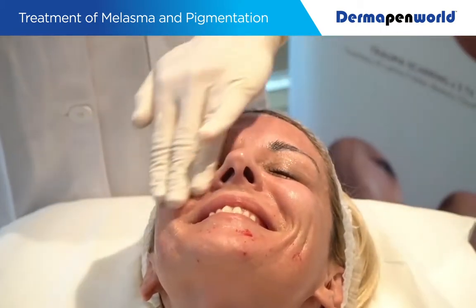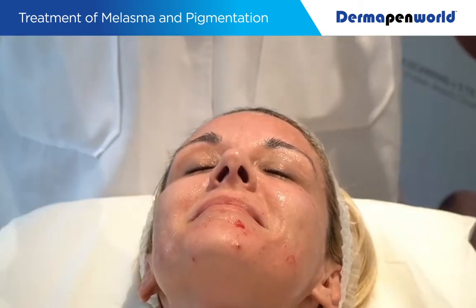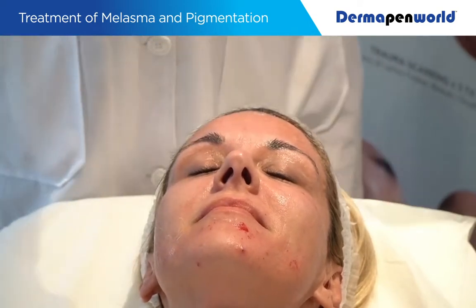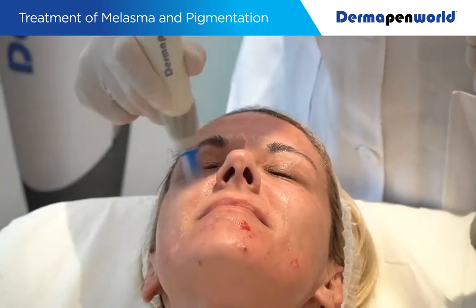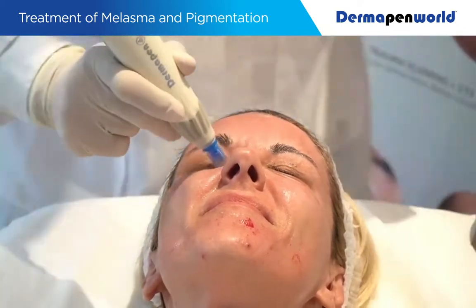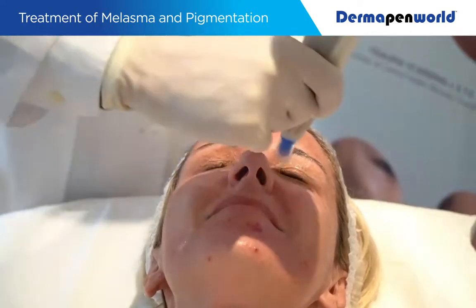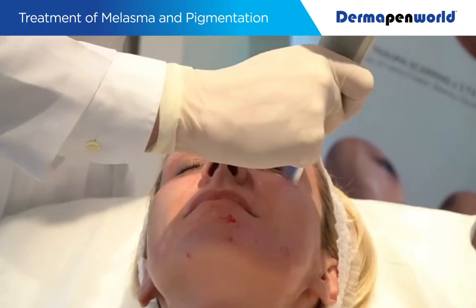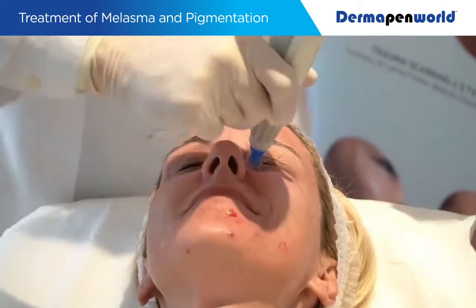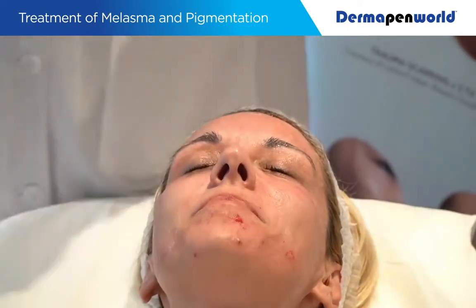The eyes are going to feel weird. You don't feel any pain. So you feel like your eyeball is like zzz. So it's not painful at all, it's just very strange. So diagonally out, diagonally back in, horizontal, through the trough and up but not into the eyebrow. Can you feel your eyeball vibrating? It's strange, isn't it? So it's not sharp, it's not painful, it's just weird.